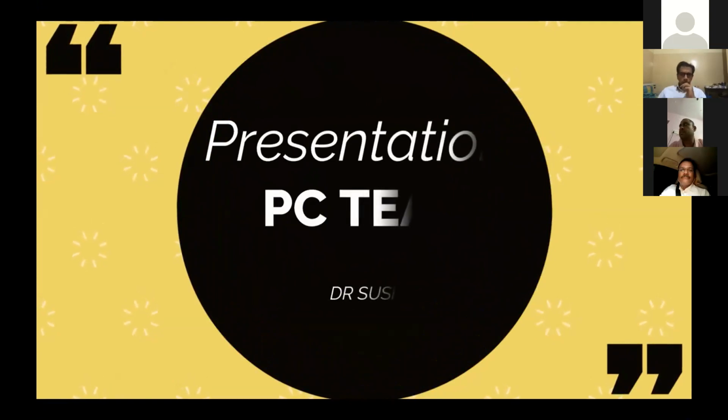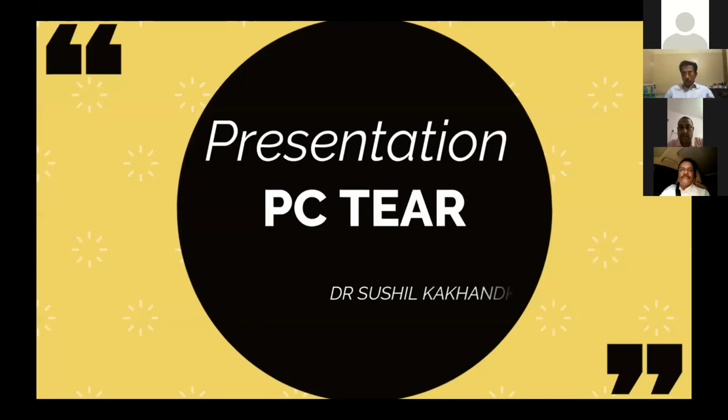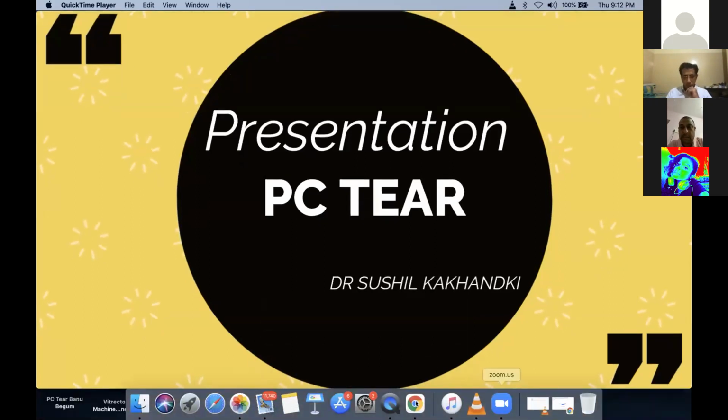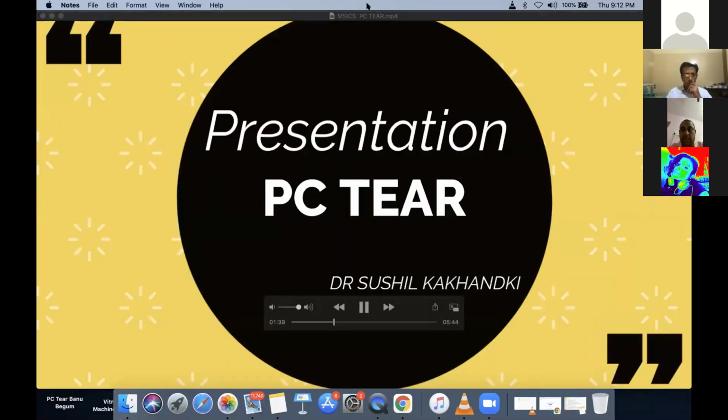So it is very important for us to understand the cause of the posterior capsular tear, so that the essential basic steps can be taken to prevent it. Prevention is the best form of management, and assessing the predisposing factors plays an important role. According to me, the first thing I focus on is the microscope. Focusing on the oculus is very important, and the second most important thing is your IPD settings. For beginners, diplopia and improper IPD settings will always lead to a posterior capsular tear. And sitting comfortably on the operating chair is very important.